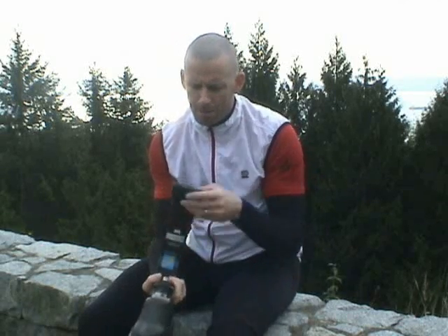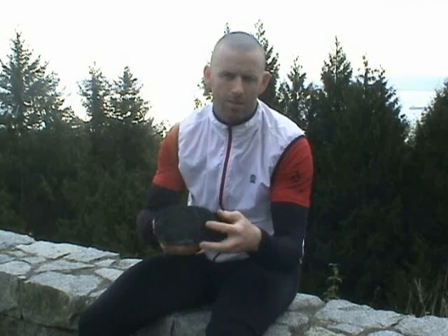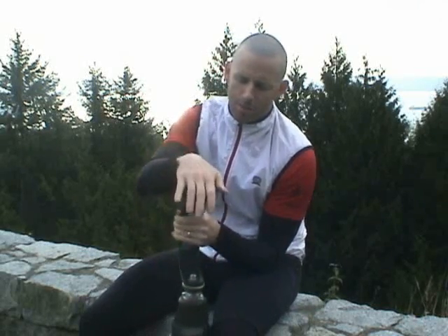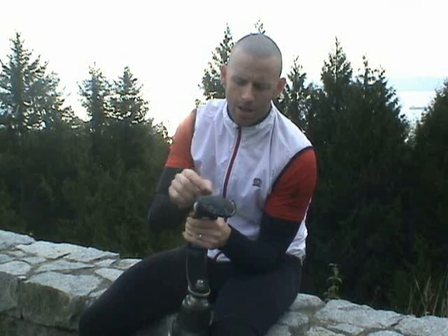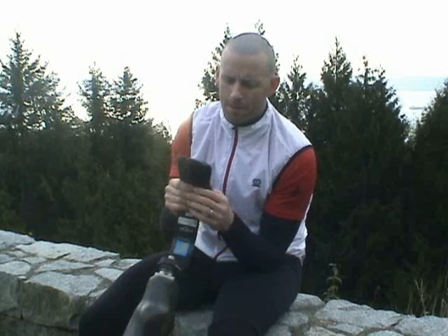What he attaches for a grip, and I need a new one, is a piece of what's called retread. This is essentially what truckers buy to attach to their tires when their tires begin to wear out. What's good about it compared to what a lot of athletes do is that they cut up their extra running shoe and stick the sole there. There are a few reasons why I prefer to go this way. One, this is way more durable than the sole of a running shoe. Two, you don't have to chop up your other running shoe, so you can still wear a pair of shoes and look normal when you're not actually running.